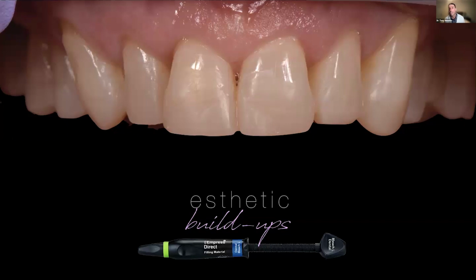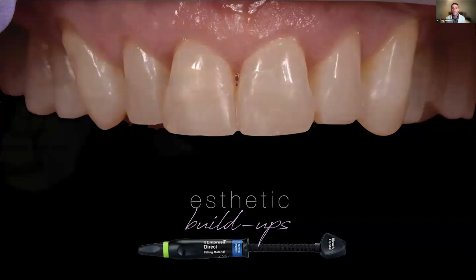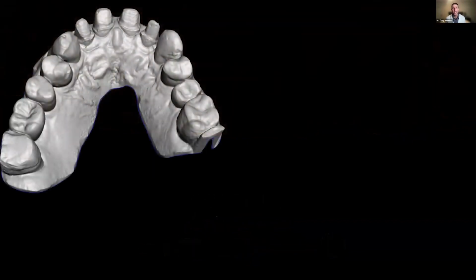There was some wear, Meredith, which is a good question. They wear a little bit, I would say a little bit faster than tooth structure, but it wasn't that significant. I think I saw maybe just a wear facet on 1 or 2 areas. So while this definitely will wear faster than a ceramic material, I did not think that it wore as quickly as some of the printed materials that I've seen, including one that I had placed in my own mouth, by the way. I won't talk about that today, but I've seen firsthand how much these materials wear.